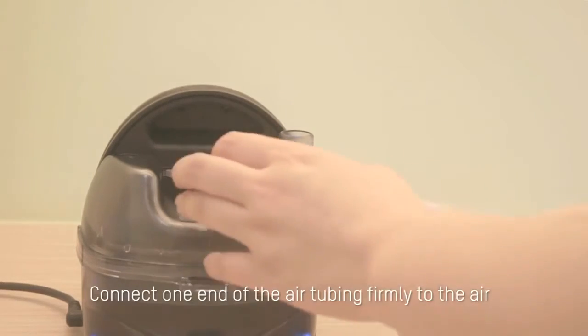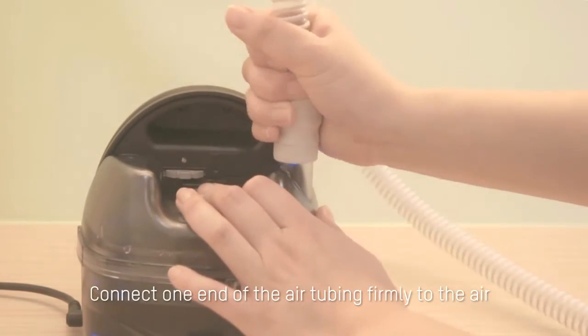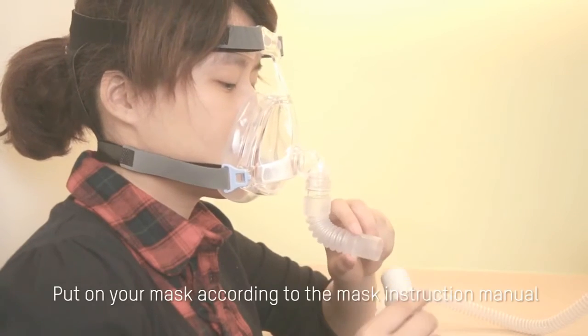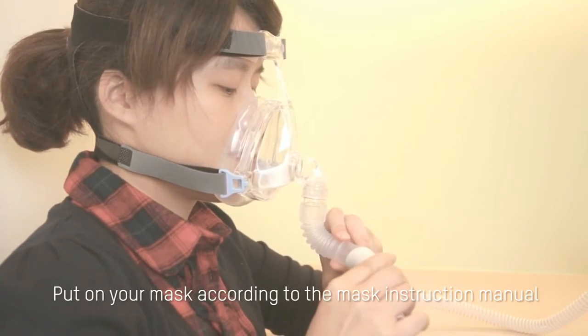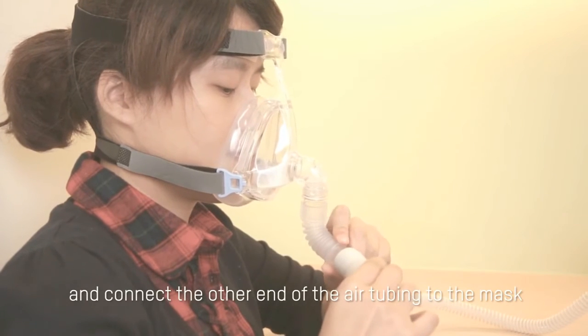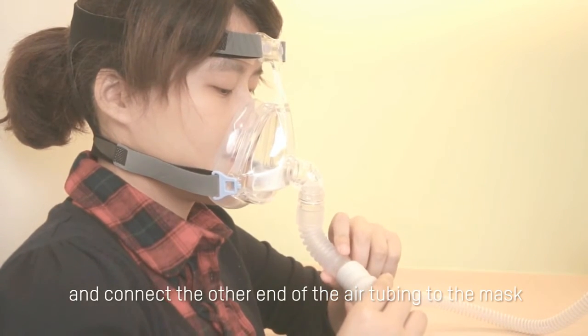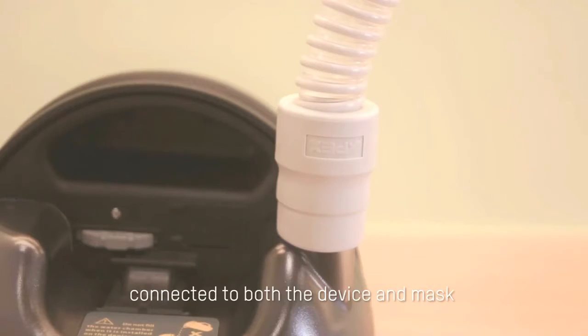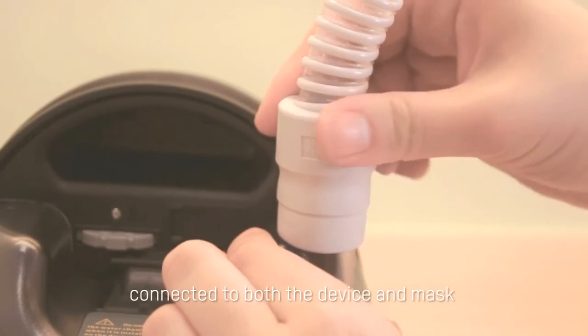Connecting the tubing and mask. Connect one end of the air tubing firmly to the air outlet on the water chamber. Put on your mask according to the mask instruction manual and connect the other end of the air tubing to the mask. Check both ends of tubing to ensure they are tightly connected to both the device and mask.